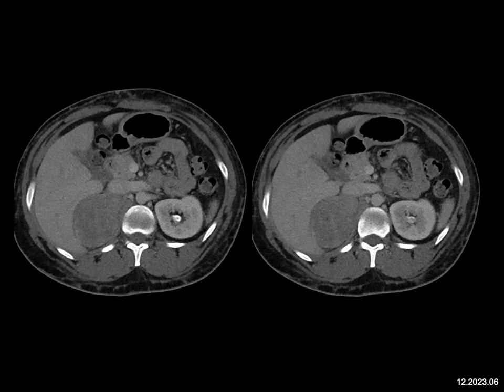Lymphoma unilateral is uncommon and wouldn't explain the history, but it's a thought. And a primary ACC, again, is in the differential diagnosis, surely. The thing that would be unlikely would be an adenoma. This is too solid. Yes, we get atypical adenomas or adenomas that had prior bleeding, but at the end of the day, the history of palpitations takes me away from adenoma, and the best answer would have been pheo.